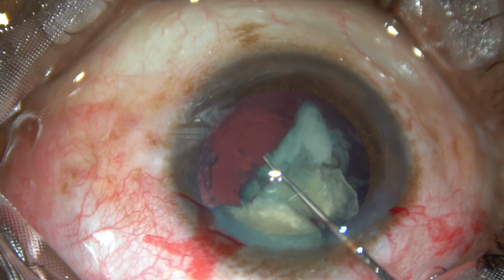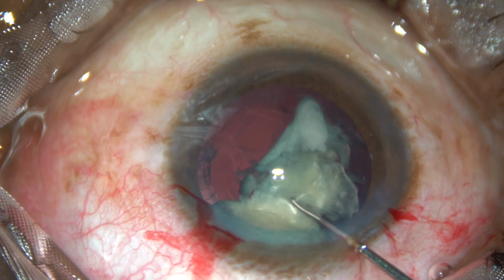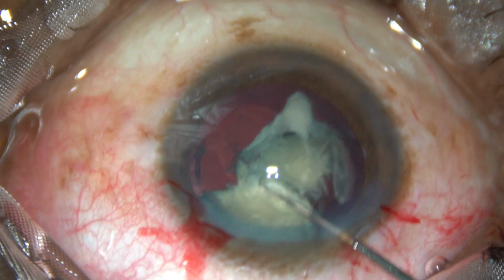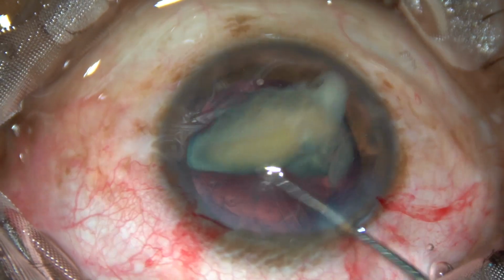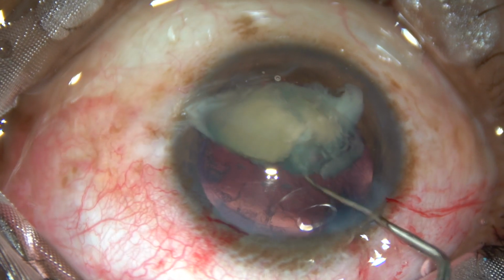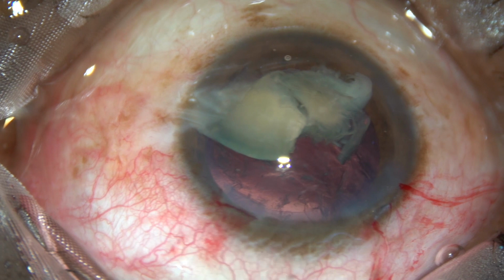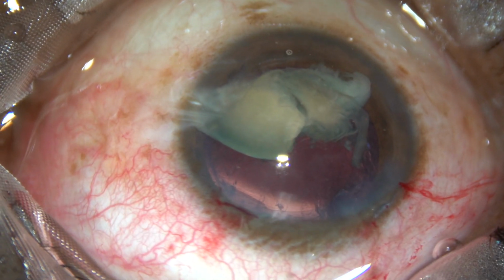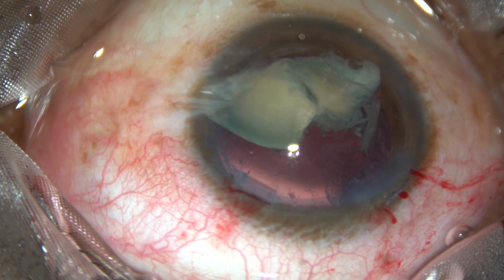So what I am doing is just observing the posterior capsular rent, and if I need to convert it to a posterior capsular rhexis or not, I just observe that. And then I thought it is not necessary. So what I am doing now is pushing the nuclear pieces downward, making some room for the intraocular lens to be implanted.